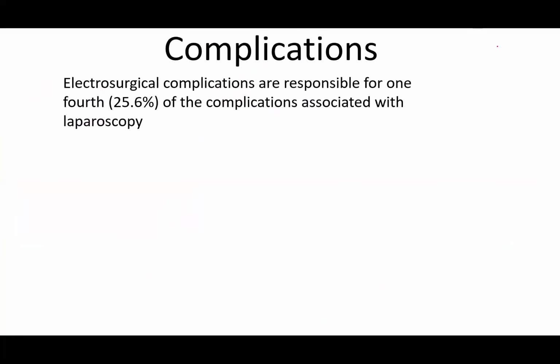Now, let's quickly look at the complications of energy sources. Electrosurgical complications are responsible for 25.6% of complications associated with laparoscopy. You remember, we said the commonest cause of complication in laparoscopic surgery is port entry. Second is energy devices, okay? So, what are these complications?